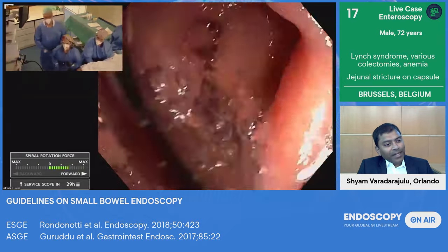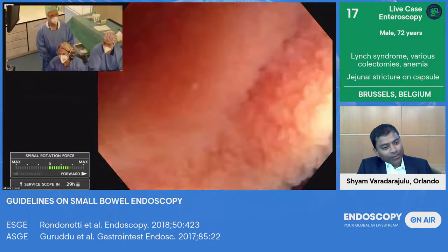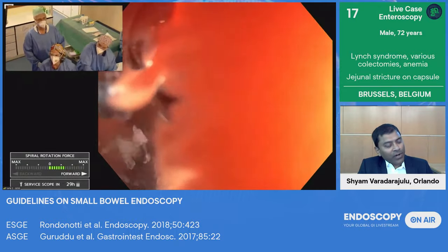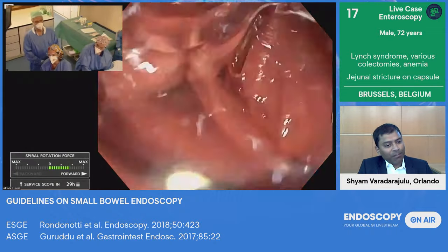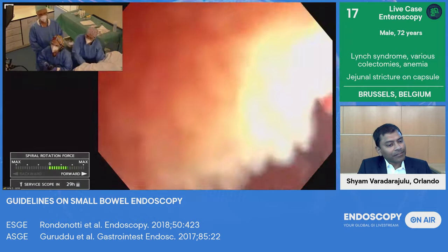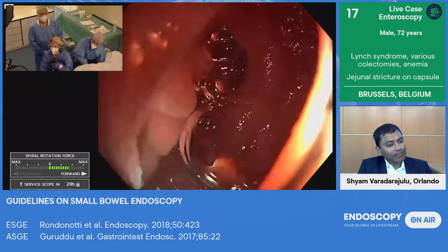So, Jacques, we have watched how this scope functions. So, what will be the plan in case you are going to be struggling for a while to move this forward? Do you have any other plans in mind, or you'll just continue to persist with this? So, looking at the timing of the capsule, I'm quite sure that we will reach the lesion.